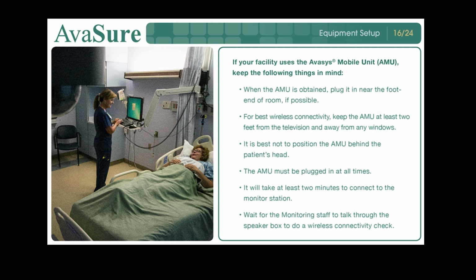It is best not to position the AMU behind the patient's head. The AMU must be plugged in at all times. It will take at least 2 minutes to connect to the monitor station. Wait for the monitor staff to talk through the speaker box to do a wireless connectivity check.